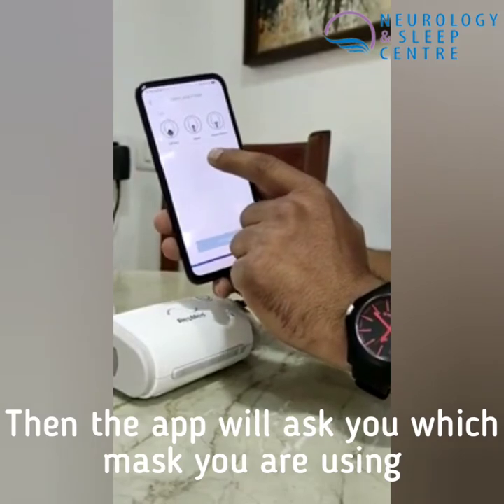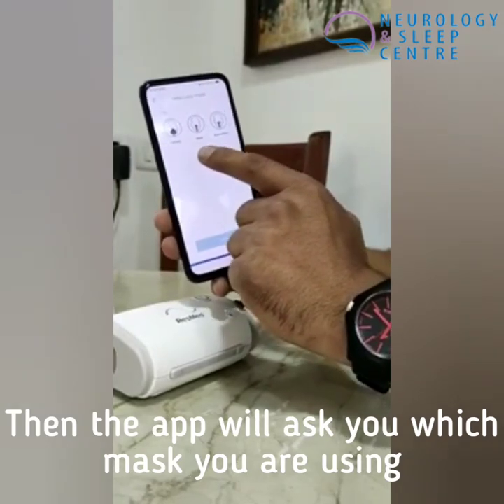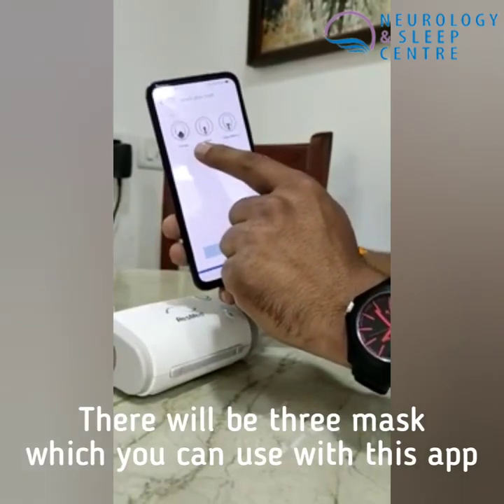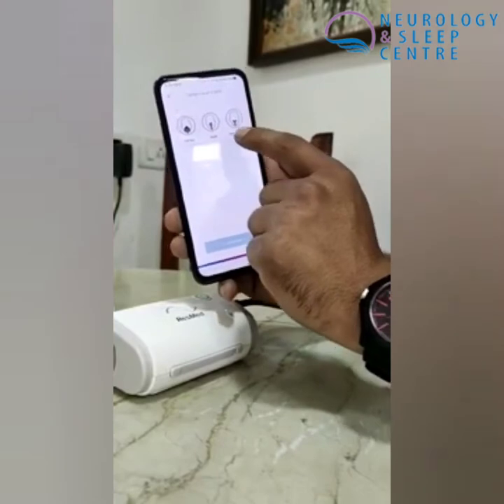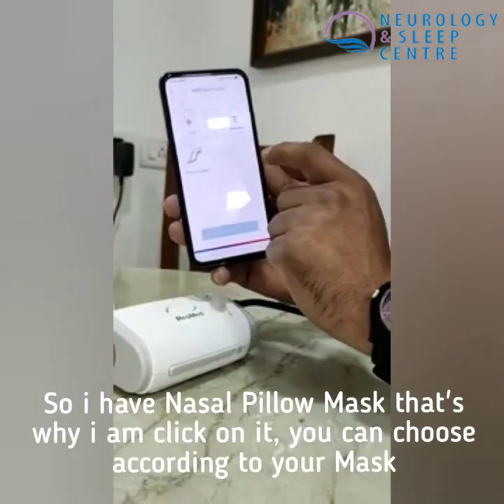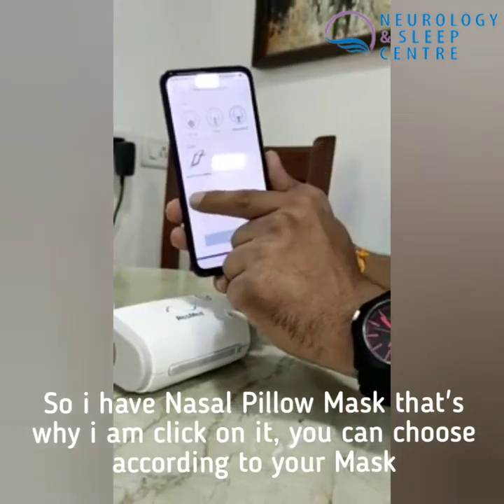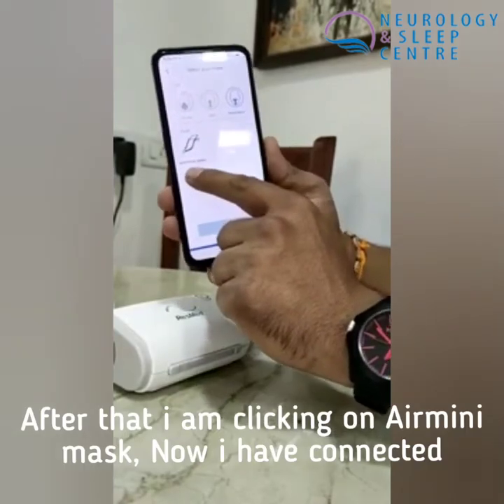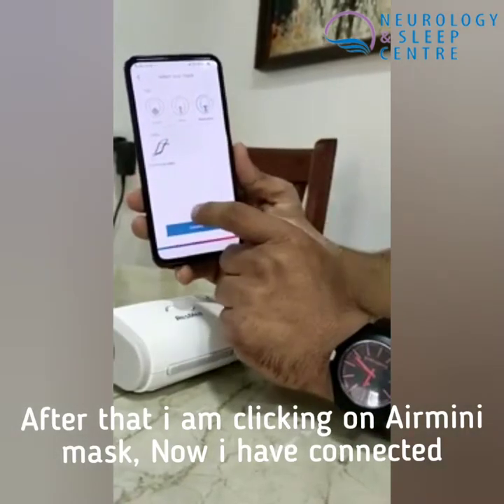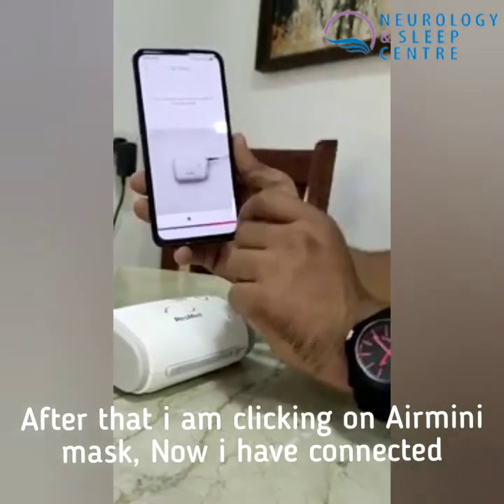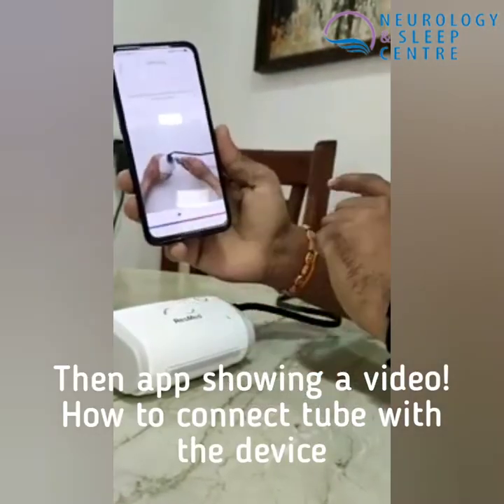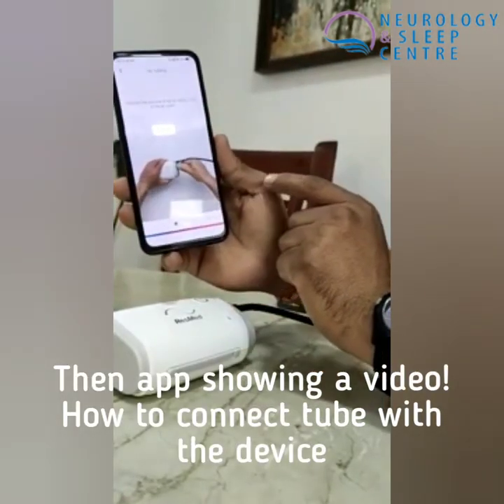The app is asking which mask you are going to use with the device. There are three mask types: full face, nasal, and nasal pillow. I have a nasal pillow mask, so I press on nasal pillow. The mask name is the AirFit P10 AirMini mask. I've selected and connected it.